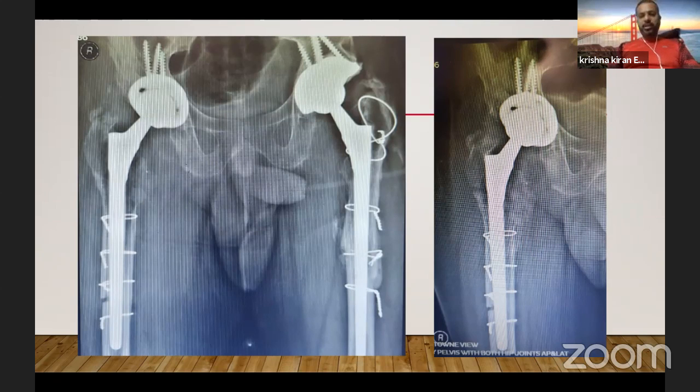As you get older, you get wiser, you get better with your surgical technique, you get more patient, and are able to deal with the situation. So the situation on the right is much better than the left, because now we have an option of putting in a 265 whenever we have to revise the right side, but we now have to go for a 305 if we have to revise the left side. So we need to not burn our bridges whenever we do a revision. It's easy to do a total femur prosthesis, but we must do the most conservative revision possible for that particular patient using the shortest length of implant, which is stable and has potential for long-term biologic ingrowth.